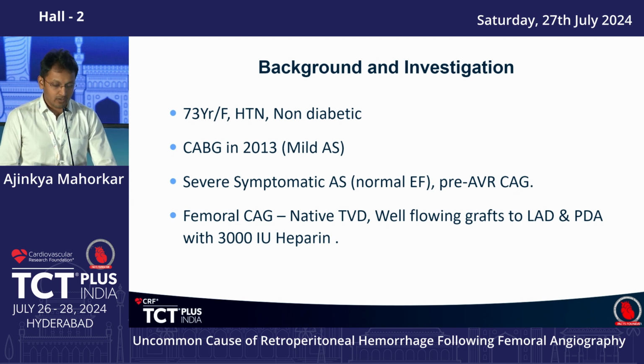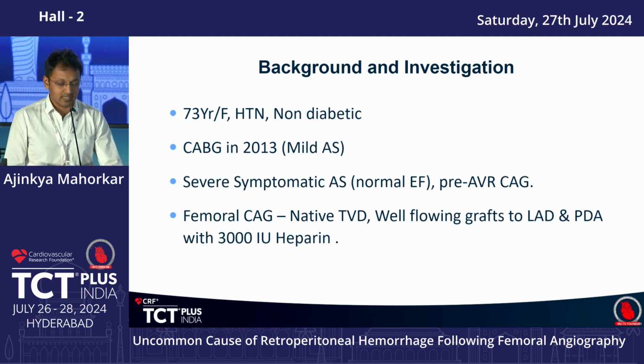underwent a pre-AVR CAG. We did her femoral CAG. The native vessels were diseased and there were well-flowing grafts in LAD and PDA. We had used 3000 international units of heparin then.